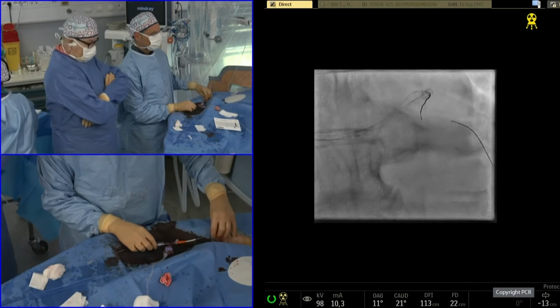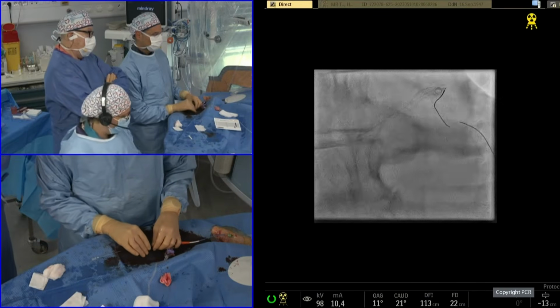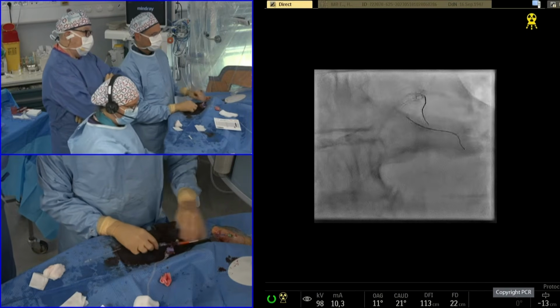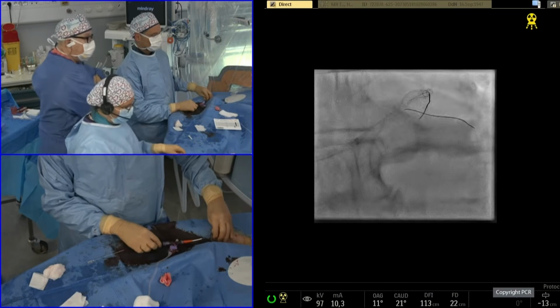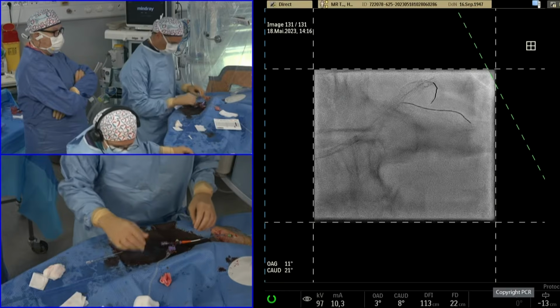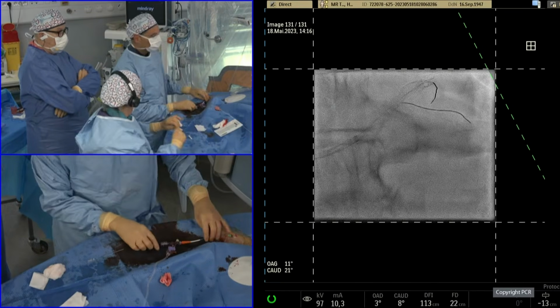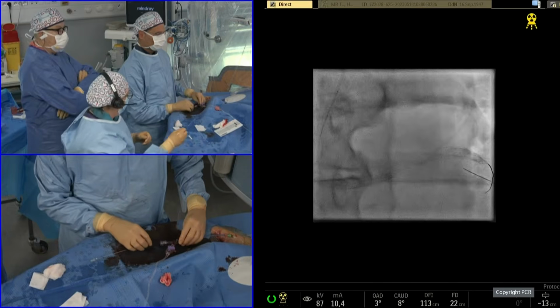stent. So there's some questions here procedurally, Bernard, regarding the kissing inflation. So you mentioned POT-side-POT in the KISS study. Is there a role for POT-side-POT in this left main, or will you always kiss? You usually kiss, but again, we don't know which one is the best approach.